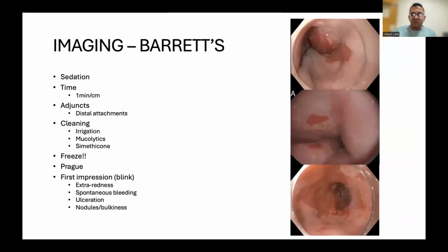And the crux is you got to get it right the first time, because if you don't get it right the first time and you go with the wrong therapy, you often lose that opportunity to cure your patient. So if you do an endoscopic resection and you don't get a good margin on the lesion because you misassessed it, you then get fibrosis and you've lost the opportunity to actually cure your patient endoscopically. So getting it right the first time is quite important.